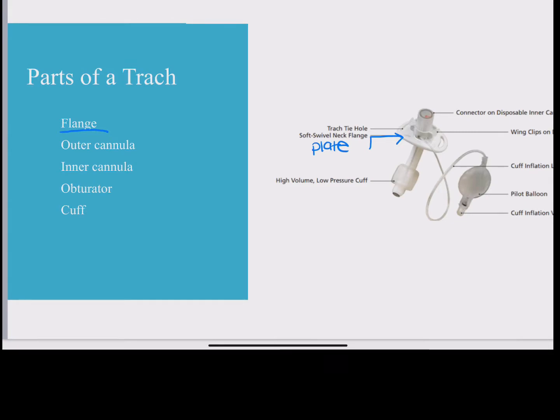Your outer cannula, which can be this little one right here.